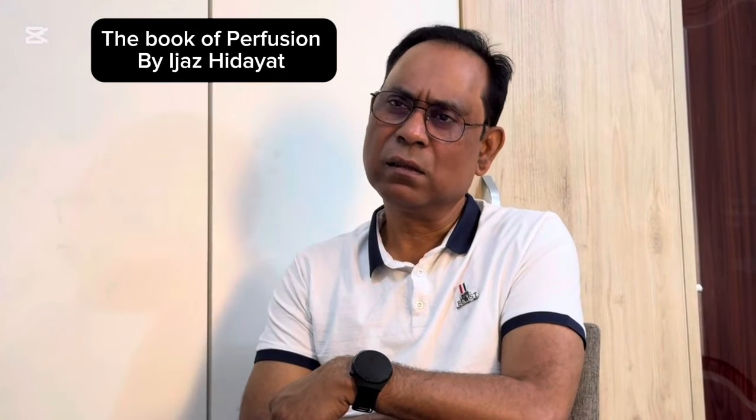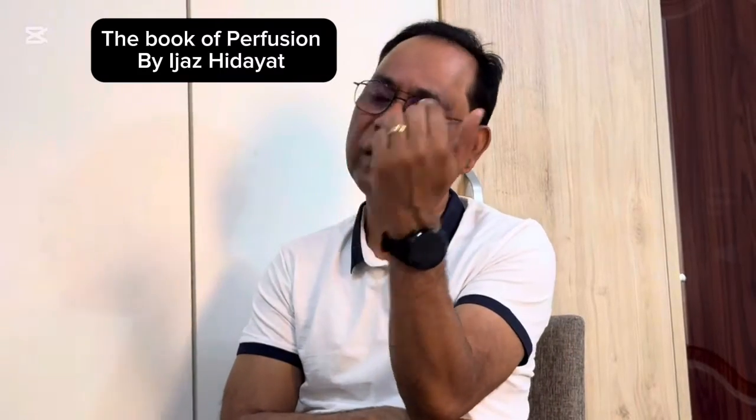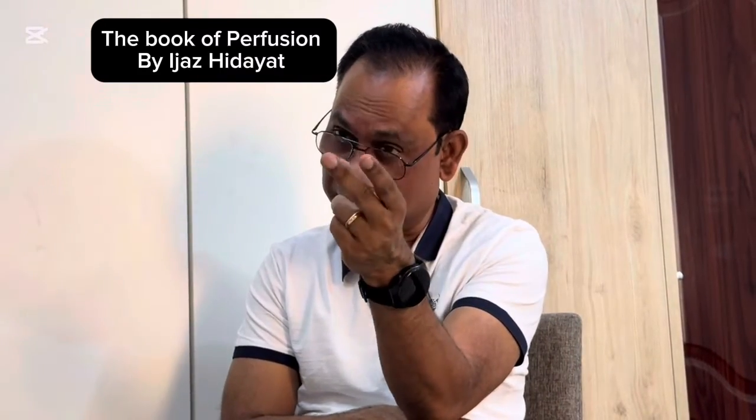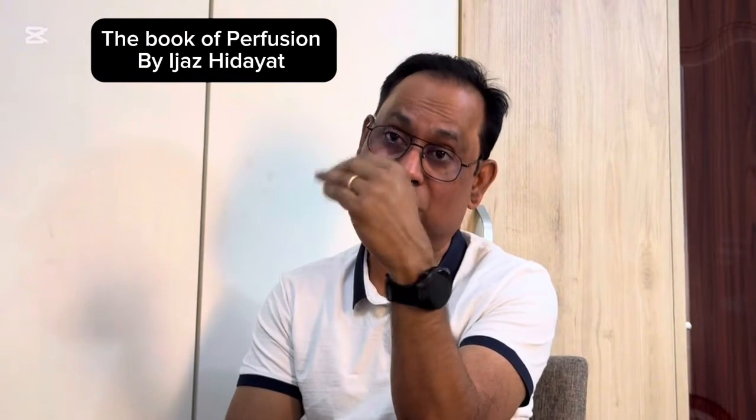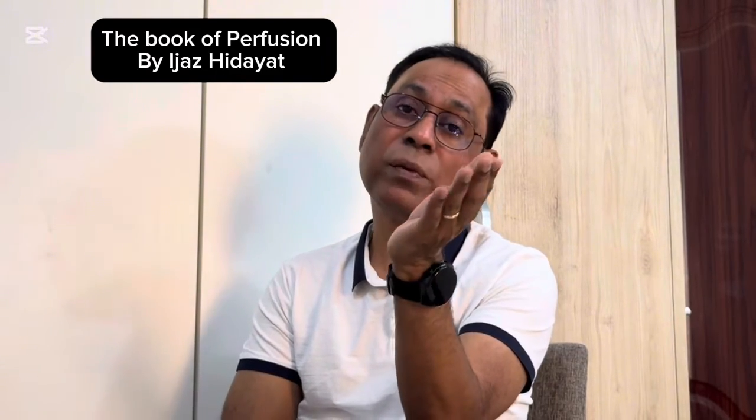Sorry, but I think we can do the central with the aorta. We can do the central, but the preference is otherwise. Very good question from you. Usually if your aortic arch is involved for aneurysm or dissection, then it is difficult to cannulate the ascending aorta. So the preference, as I mentioned, is to prevent traumatizing the patient.